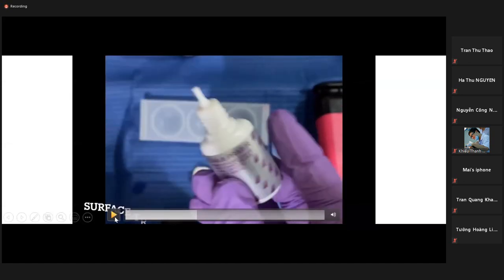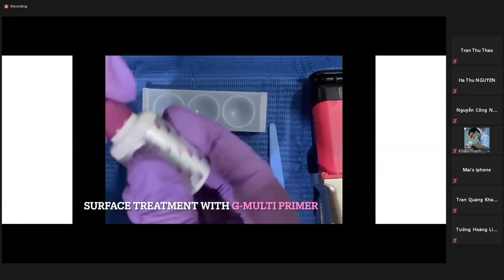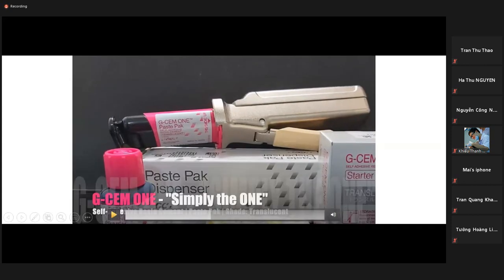So after the surface pre-treatment with hydrofluoric acid, because it's a ceramic, next we need to apply a silane coupling agent. And GC has the G multi-primer, which contains this silane. Và tiếp theo là chúng ta sẽ bôi cái primer dành cho sứ vào mặt trong. Thì GC cũng cung cấp loại primer này, nó có silane. So we apply the G multi primer and simply air dry it. There's no light curing. We just air dry it so it gets dry and then we can continue.